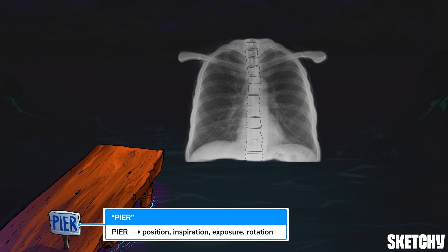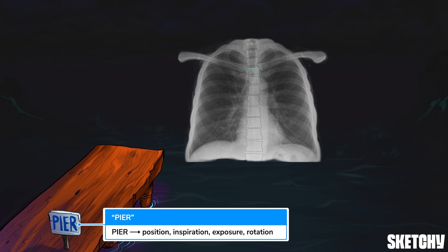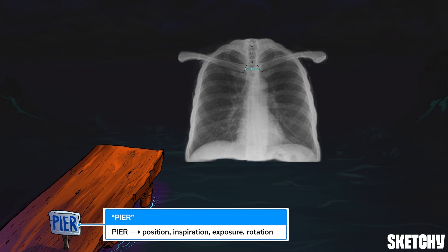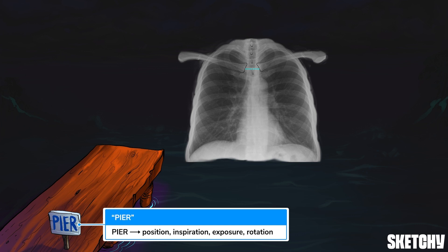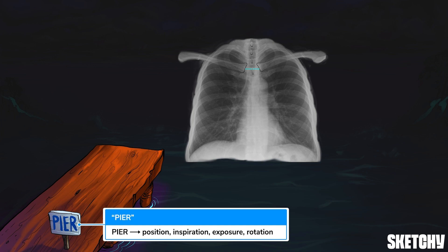Then there's exposure. The vertebral bodies behind the heart should just be visible on a well-penetrated chest x-ray. And finally, look for rotation in the image. Rotation makes things difficult to interpret, so check the distance between the medial border of the clavicles and spinous processes. If it's not the same on both sides, order another film.